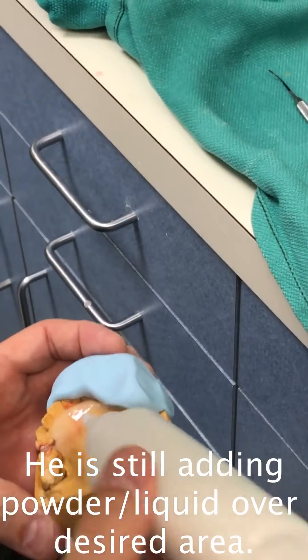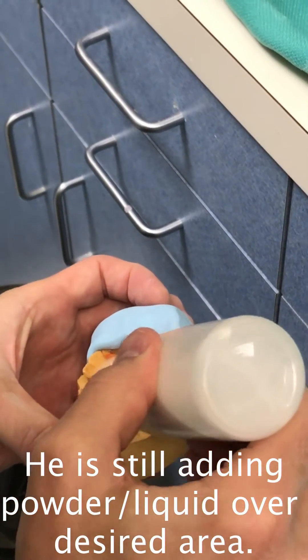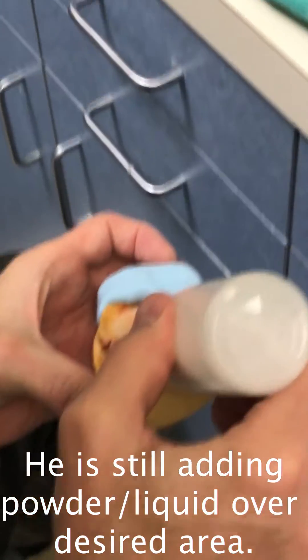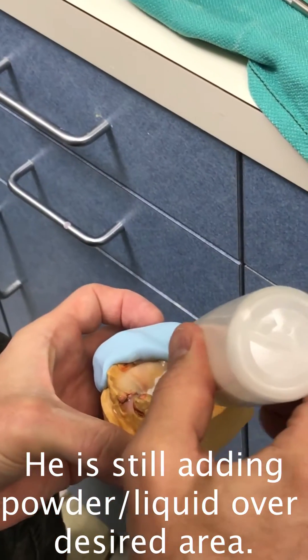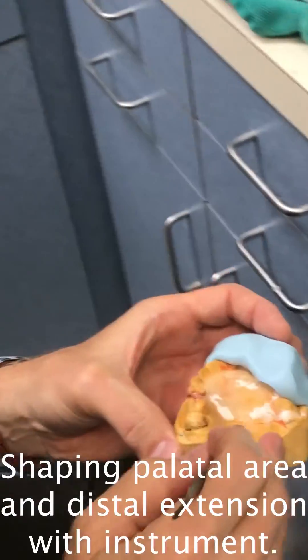Once this sets you can add a little more acrylic back here if you want to — a little clear acrylic. You can shape this while you're doing it.